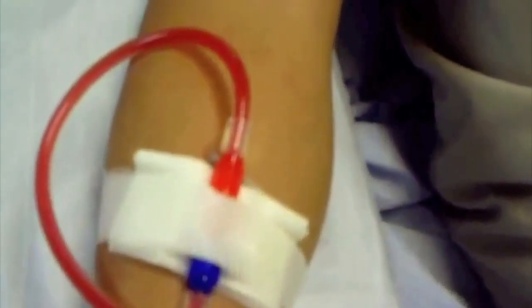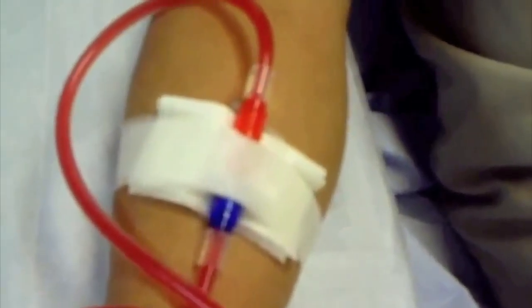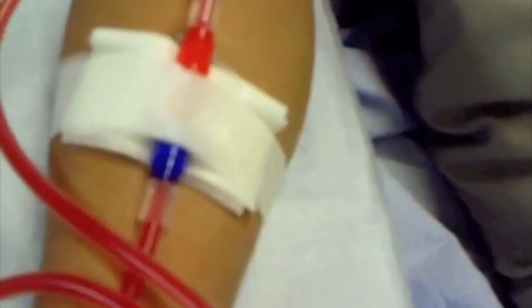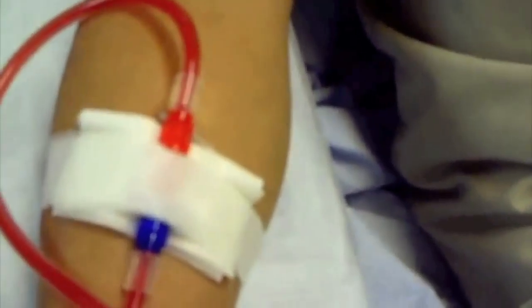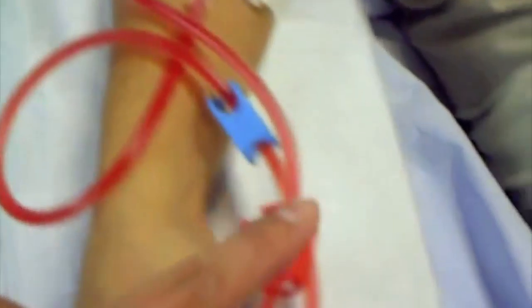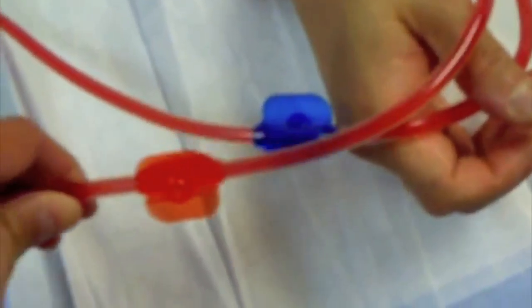An arteriovenous graft is created when a fistula is not a viable option for a patient, such as those with a compromised vascular system. Two needles are inserted, one for the arterial line and one for the venous line. The arterial line is going outside the body and going to the dialyzers, and the venous line is the one that's going back to the patient.